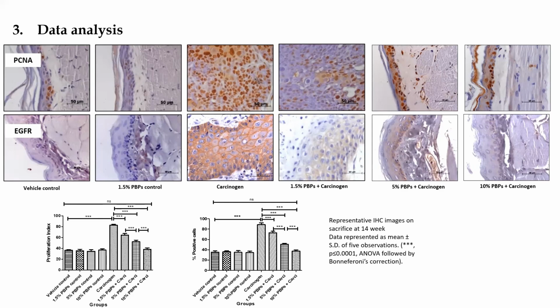You mean to say what is the amount of expression of this PCNA? Yeah, amount of expression. Amount of expression in PCNA and EGFR. So these are the 10x images, that is microscope 10x magnification. These are 40x images of the same. So basically, this is the 40x images of the PCNA and these are the 40x images of the EGFR.